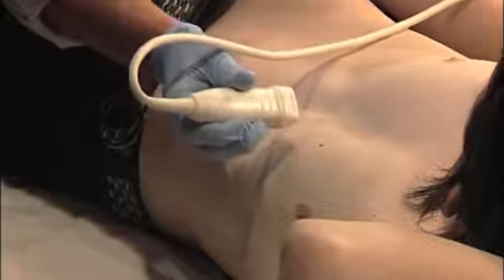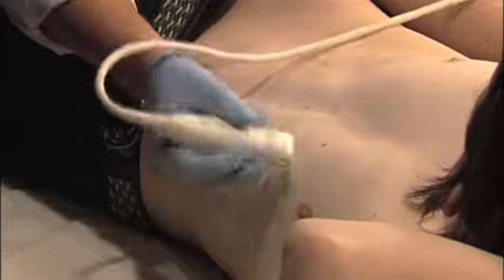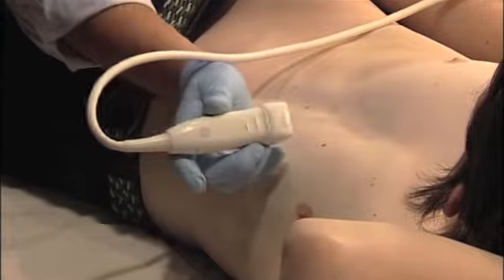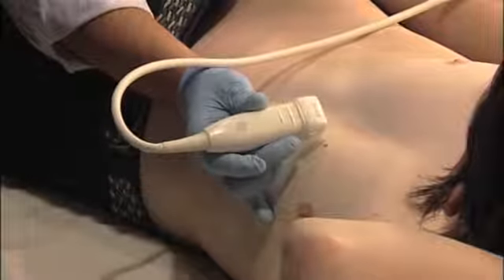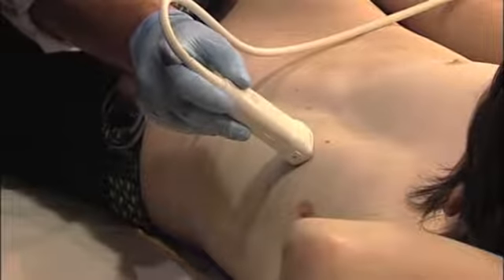This does not necessarily have to be the same finger all the time. For example, if I rotate the transducer, I would then feel it on the thumb, but thereby you always know in which rotational state you are. The next thing which is very important is to try to have body contact. So I try to leave my whole entire hand on the body, and thereby I have much more stability versus holding the transducer like this.